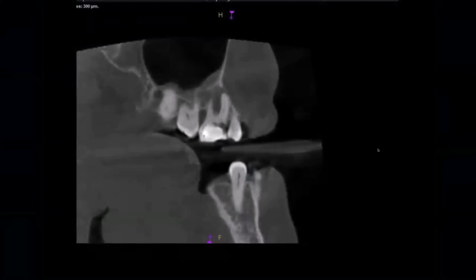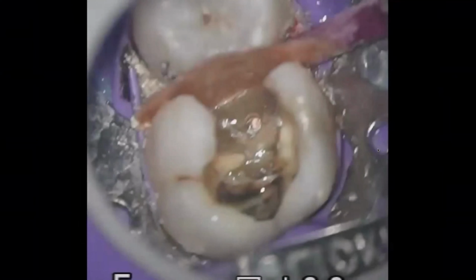So this is an example where my intention was not necessarily to do a full gingivectomy. My goal was, would I be able to create a good seal of that margin without having to go through what I had shown before? So the idea is let me rebuild the wall, then perform the endo. And sometimes that workflow actually ends up working better.